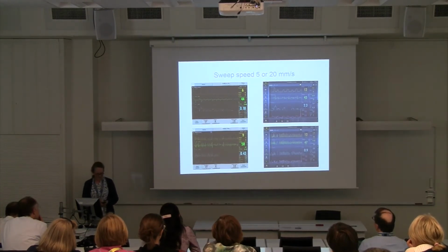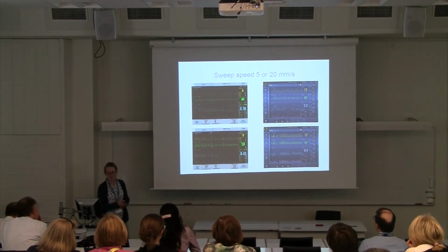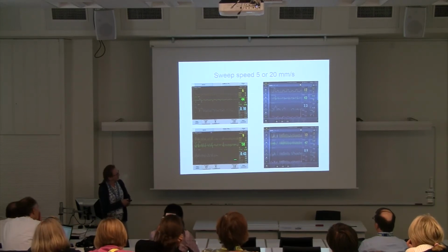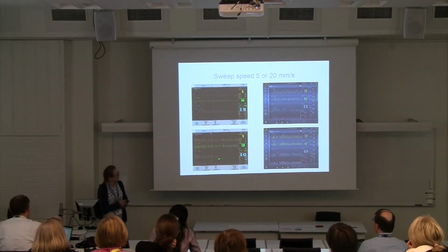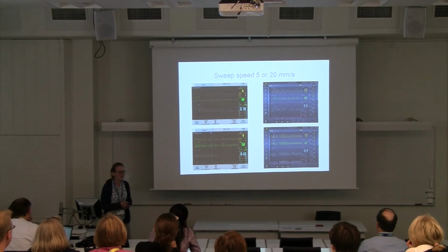And I have switched here the sweep speed to 5 millimeters per second. And here you can see 40 seconds of breathing. And I think this is so wonderful, always to see how irregular the breathing is in very preterm infants.